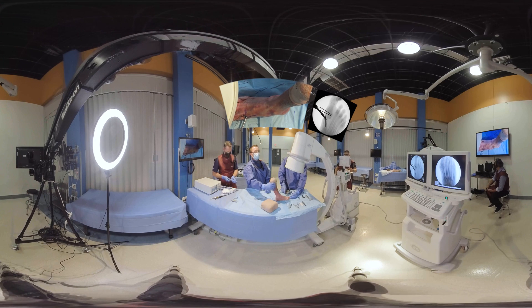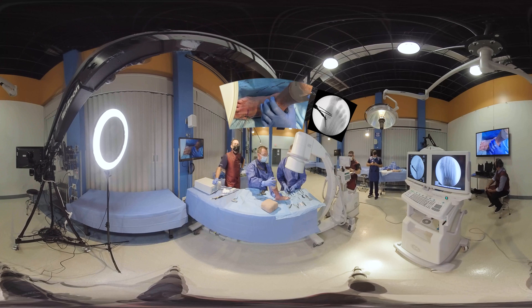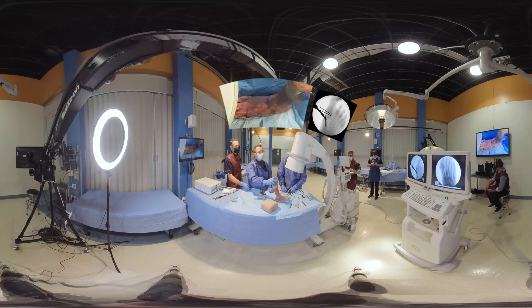You can see if you're not as straight, you'll never catch that lateral cortex if it's more angled — so you want to keep it straight. We'll drill that. The oblique screw here, we're going to just do it snugly, not too tight. And at the end, we'll add a little bit more compression. So that does advance the screw, as Dr. Campbell mentioned, so we want to be careful not to advance it too far. If we have extra threads through the other side, I haven't had that be a problem from a clinical standpoint.